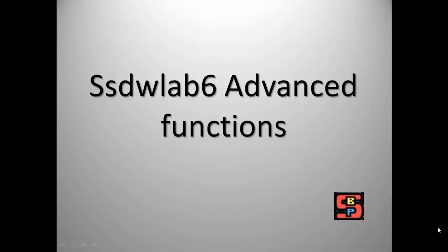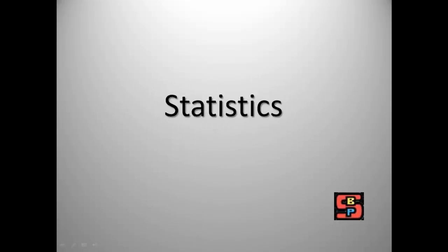In previous videos we have seen some of the quality controls that make SsdwLab 6 a unique program in the aneuploidy and preeclampsia screening. In this tutorial we will show several options that can help us to get a better performance of SsdwLab 6 potential.